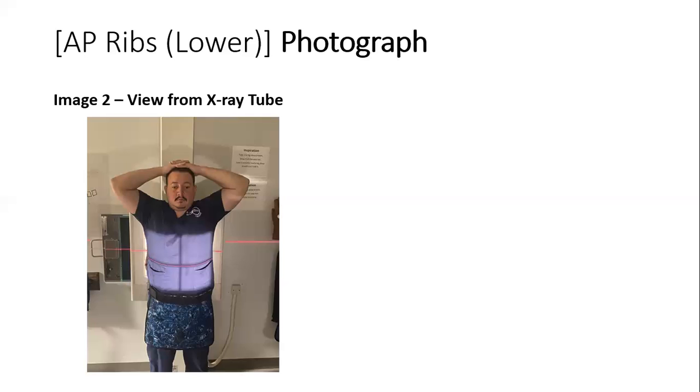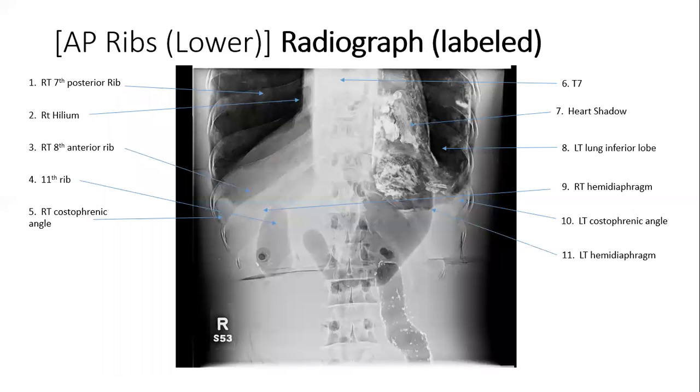The anatomy demonstrated in this should be ribs 10 through 12 should be visualized within this image. Our items in profile should also be our lower ribs, and the pathology that best demonstrates this clinical indication will be the pathology of the ribs, including fractures and neoplastic processes.